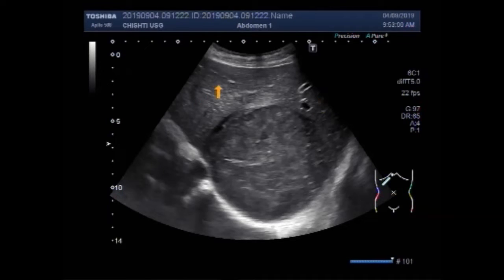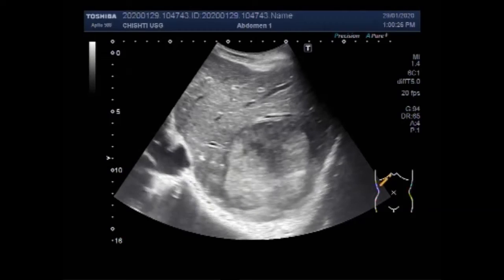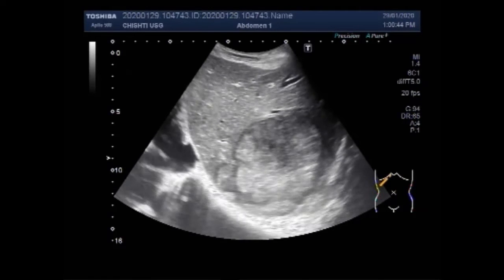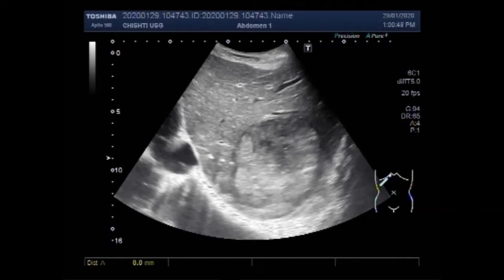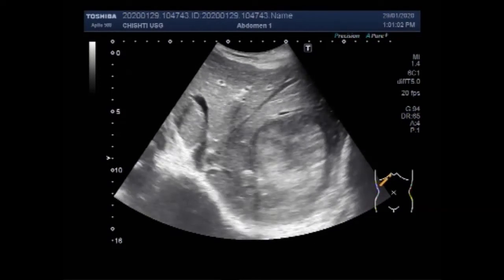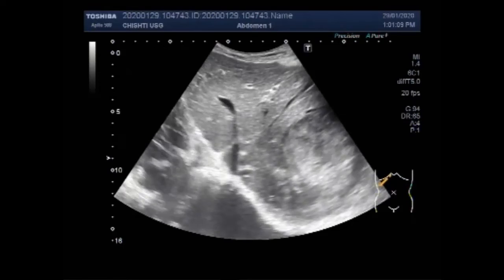Now you are going to see the second video. This second video also shows a large hepatic mass. This mass is seen in the lower portion of the right lobe of the liver as well as the left lobe of the liver — dominantly in the lower portion of the right lobe. It is also a large one, measuring about 9.5 cm x 7.8 cm. This mass is also semi-solid to solid in consistency with no fluid in or around the mass, and it is round to oval in shape.